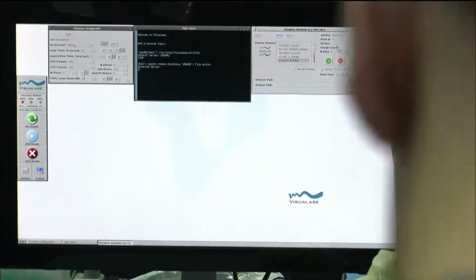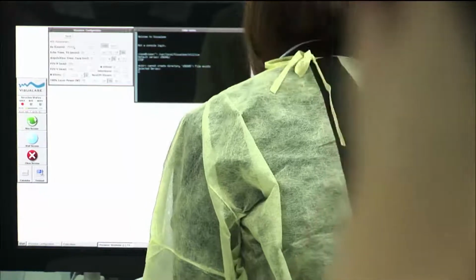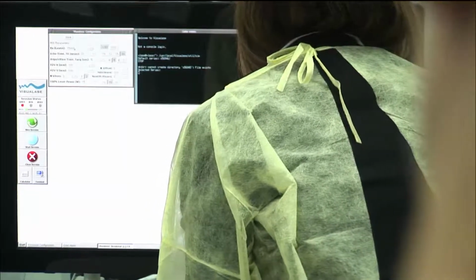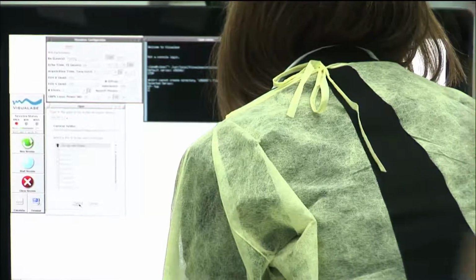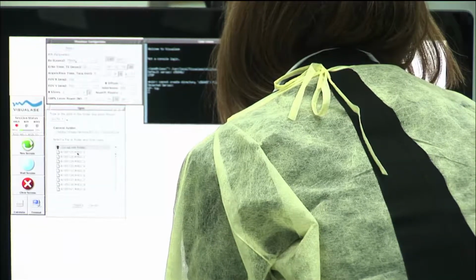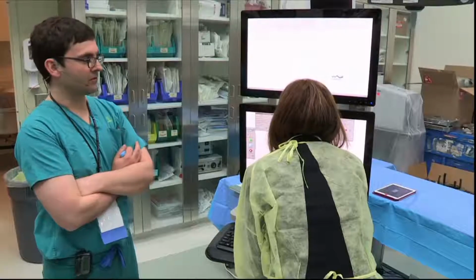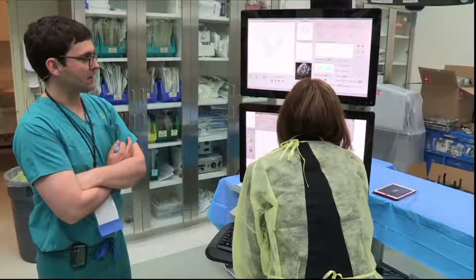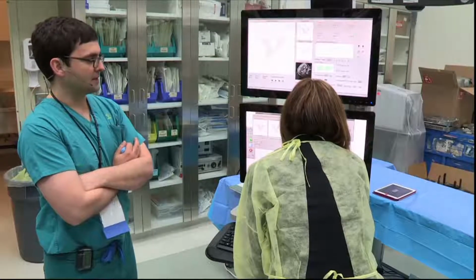And just to remind you guys, I spoke in the lecture about the temperatures we actually need to denature or damage tissue, and it's anything over 45 degrees, and really maybe just a little bit below that. Just at 45, it could be up to 60 minutes, which you obviously won't be doing in this case. But anything over 45 degrees can denature tissue.